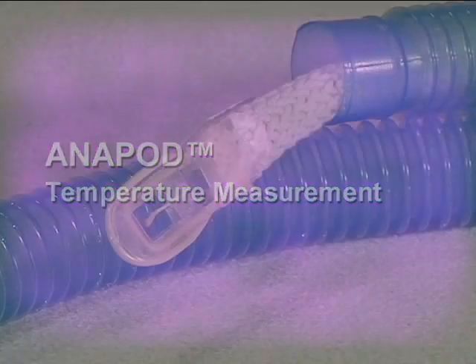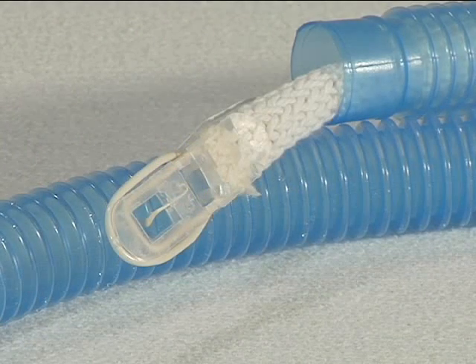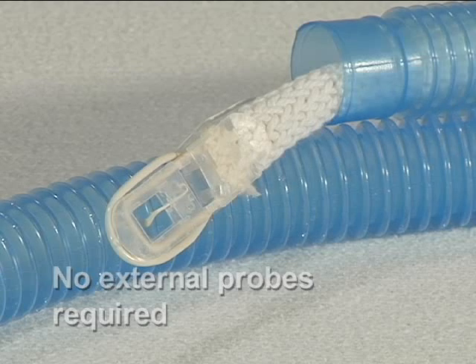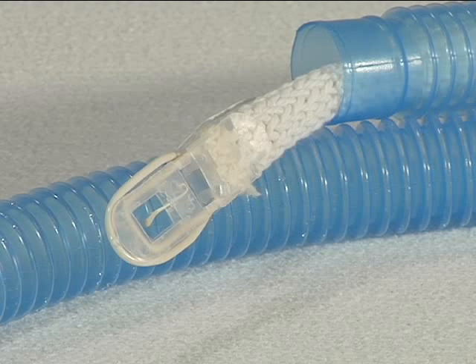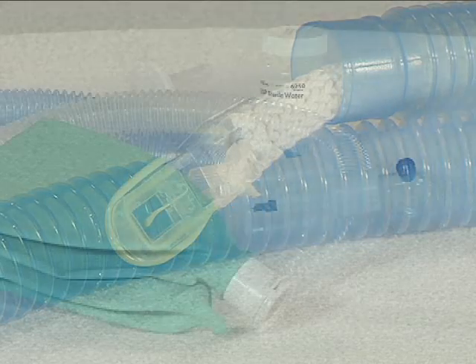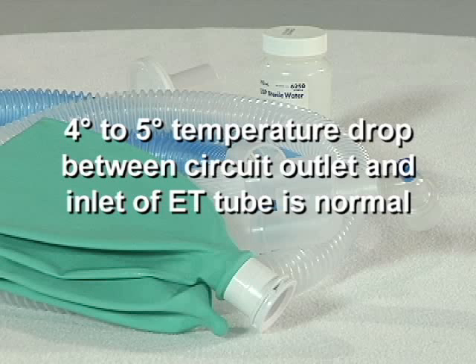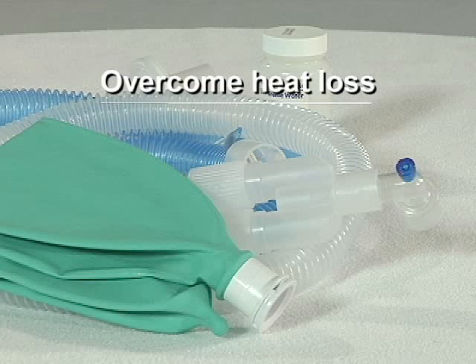Temperature measurement. The Anapod uses one temperature sensor located inside each heated wick circuit — there are no external probes to attach. This probe is calibrated to measure the temperature of the flowing gas at the patient end of the wick circuit. As with all heated systems, there is a certain drop in temperature in unheated wyes, elbows, and ET tubes. You can expect a temperature drop of approximately four to five degrees centigrade from the wick circuit outlet to the inlet of the ET tube under normal operating room conditions. It may be necessary to overcome heat loss in the last few inches of the tubing, cuff, patient Y, elbow, and/or ET tube.